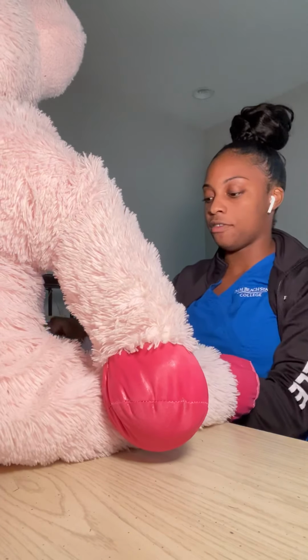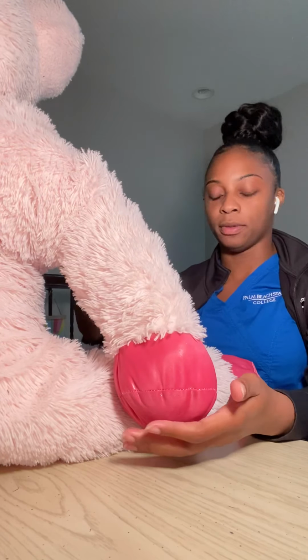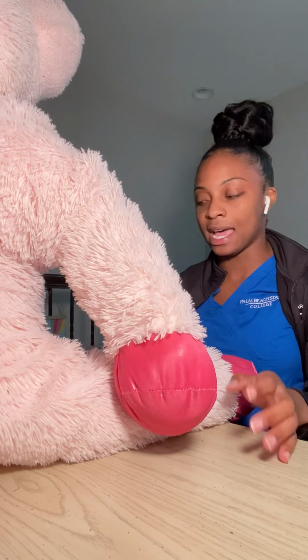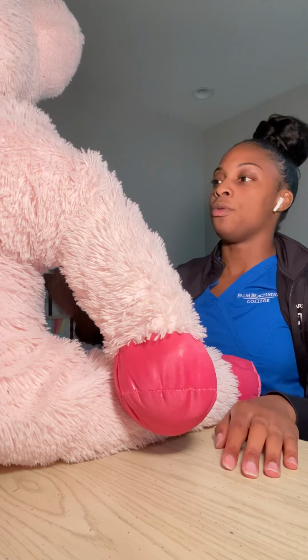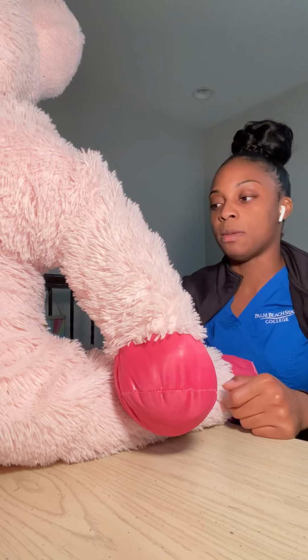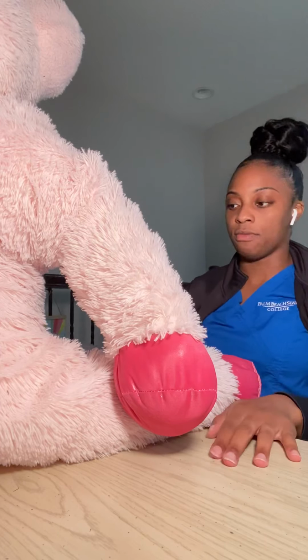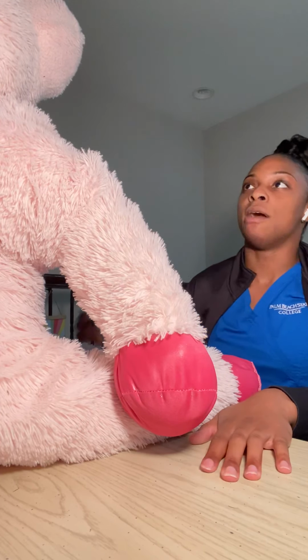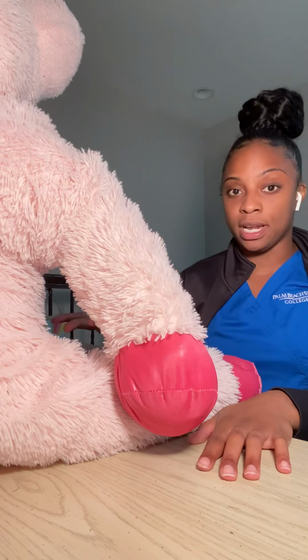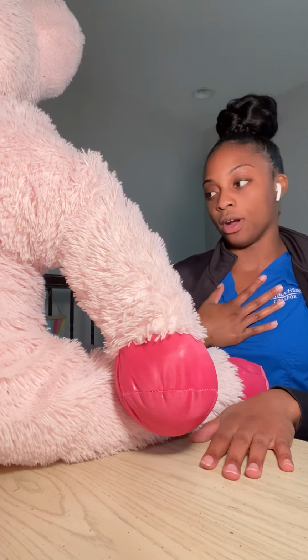So she's sitting up on the side of her bed. Her O2 sats are going to be monitored throughout the procedure, making sure she doesn't desat. It's always best to be very mindful to keep the patient as comfortable as possible. So that's my job in this. I'm going to be assisting with keeping her comfortable. She doesn't have a spouse or anything there to console her or to lean on, so it's super important that I provide that for her.